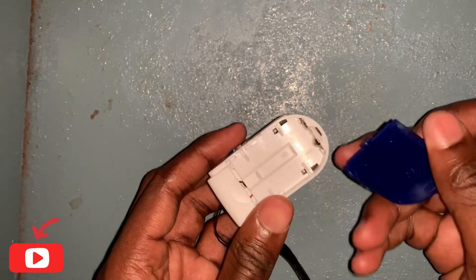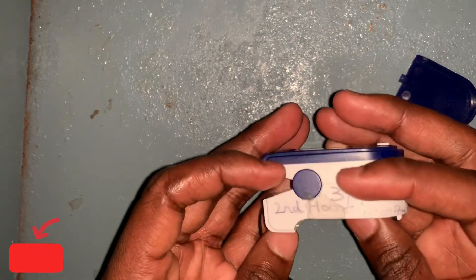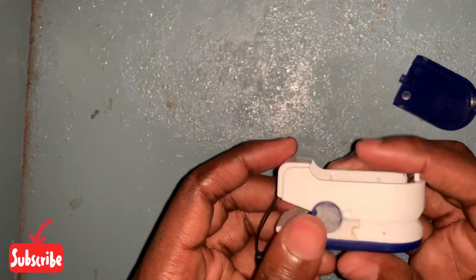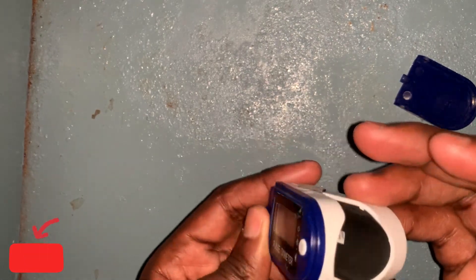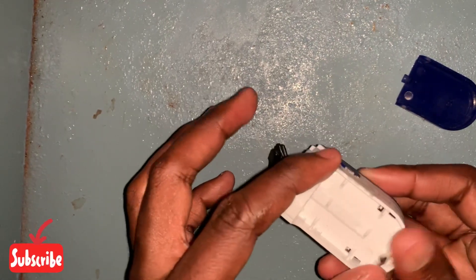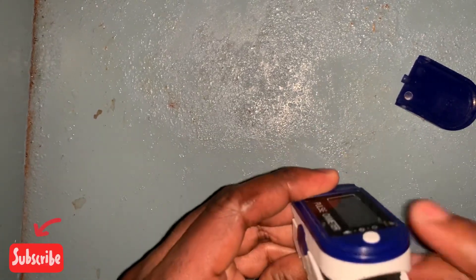This device uses battery cells and each battery cell is 1.5 volts, so in total it uses 3 volts. Here is the battery pack side and here is where you put your finger.